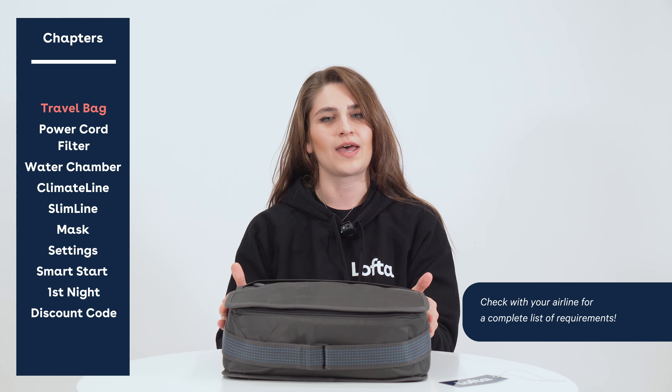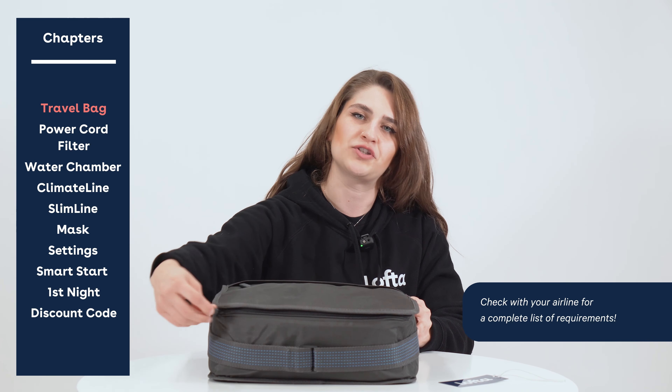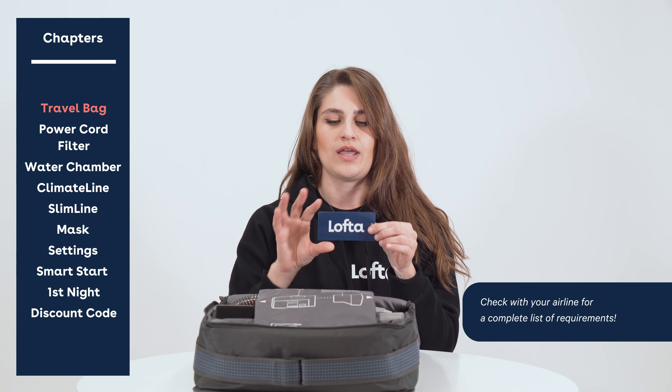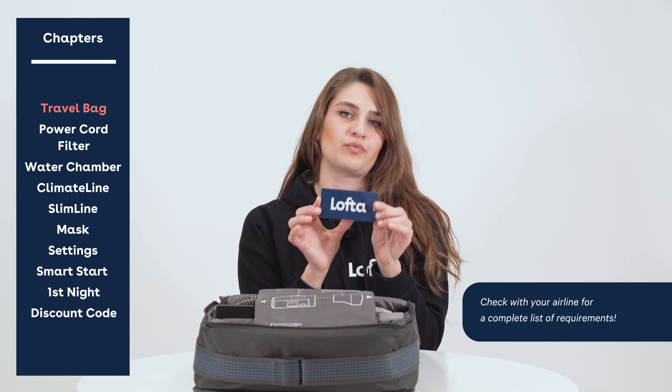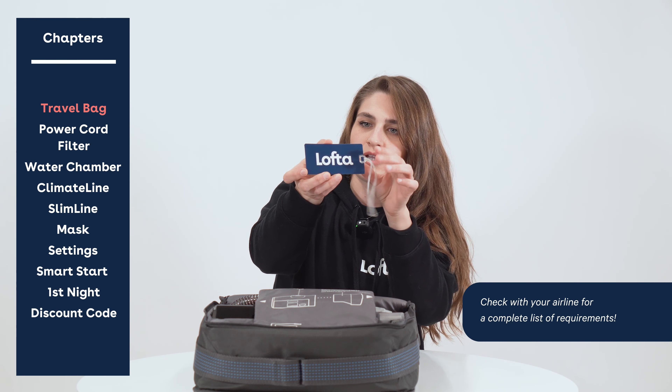The very first step is to get your device out of its travel bag that will be included in your purchase. Just so you're aware, this is a medical device so it's not considered a carry-on — you can go ahead and bring this onto your flights and it won't count towards your personal item. There's a little luggage tag included because we want you to be traveling safely.